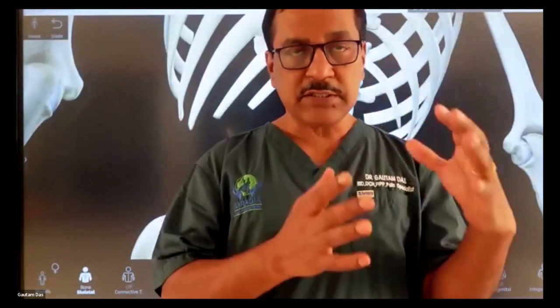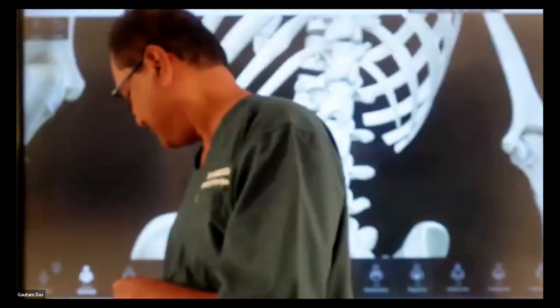First, in this 3D anatomy, I'll be showing the important structures, the important targets, where we are going to do the procedures and how we are orienting our C-arm. After this discussion, I'll take a short break to set up our mannequin and the C-arm, and then I'll start the live demonstration. If anybody wishes to share anything, you can, and then we'll start.